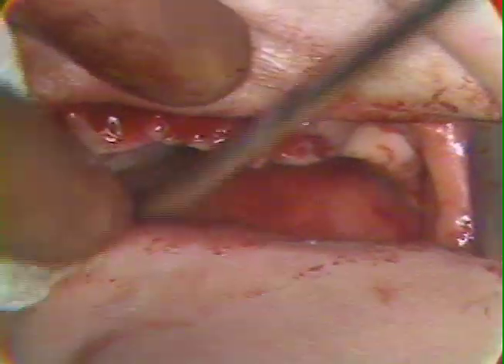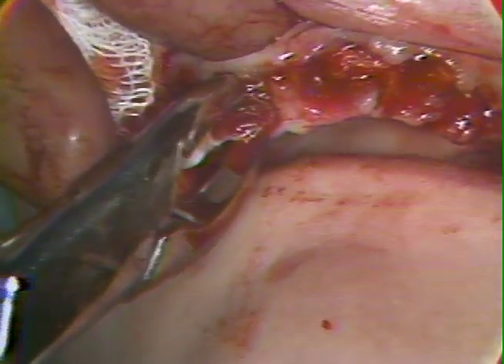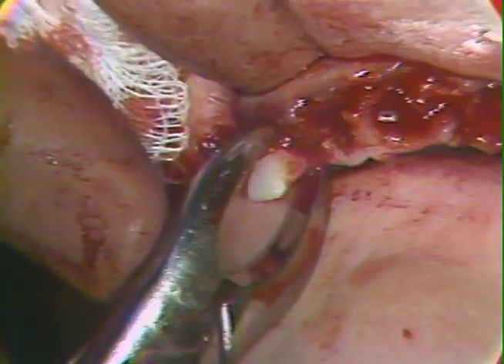So we are then eliminating the remaining bicuspid teeth, and we'll be returning to trim both bone and soft tissue in that area in a moment, but I now will complete the removal of this right residual incisor root and the lateral. That will then account for the removal of all of these teeth.